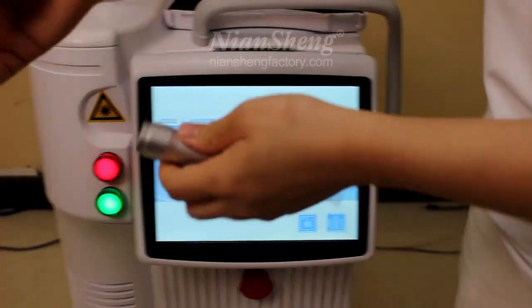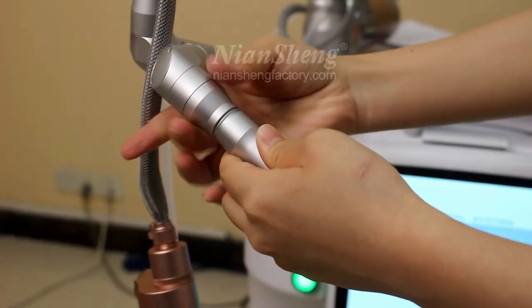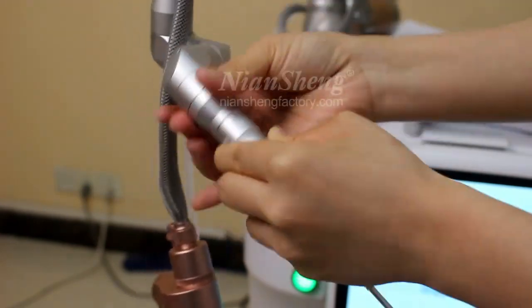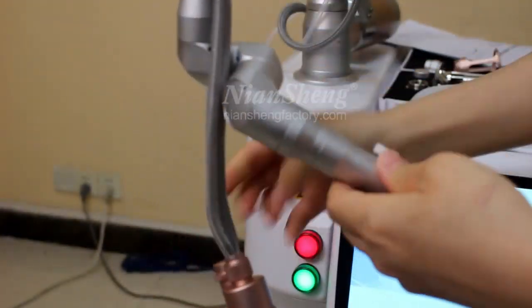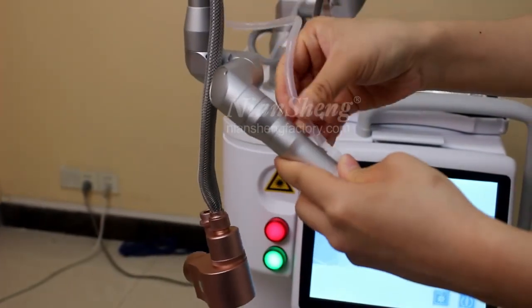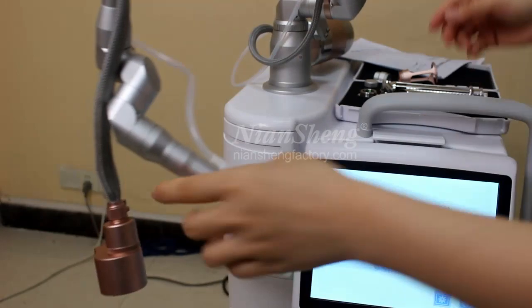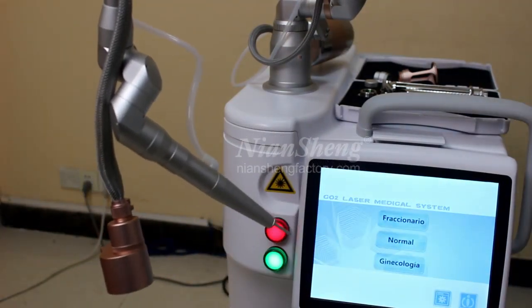Now let me show you how to install. Connect these arms — it's easy. And connect the CO2 tube. Now it's okay. And then I'll show you how to operate.